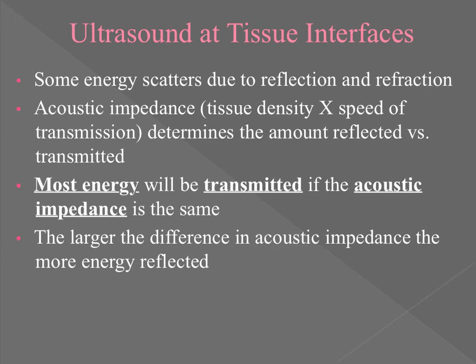What we know about ultrasound is that most of the energy will be transmitted as long as we reduce impedance. And we can do that by cleaning our patient's skin. We can do that by having hairy patients shave. We can do that by sometimes heating the treatment area, especially in our larger individuals. There's a lot of different ways to reduce the amount of impedance.